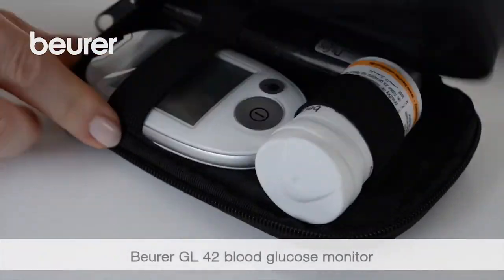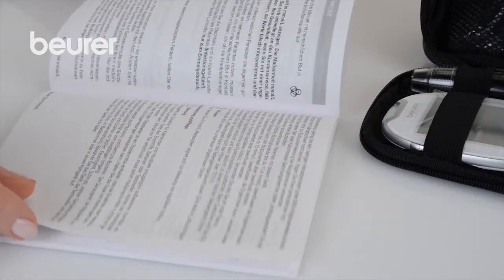This is a guide to the correct usage of the GL44. Pay attention to the instructions for use and safety notes.